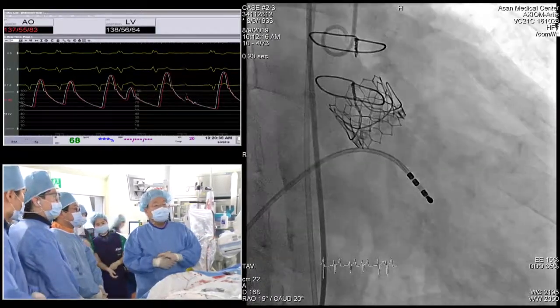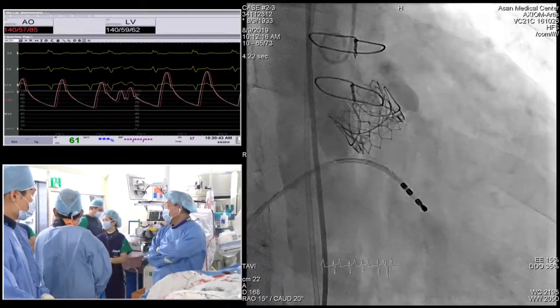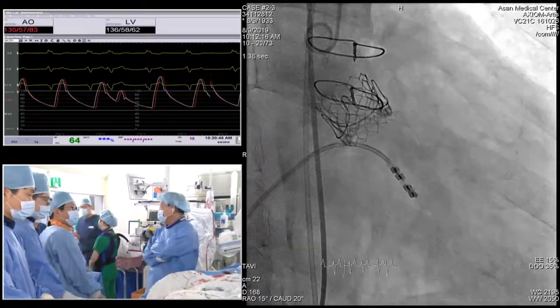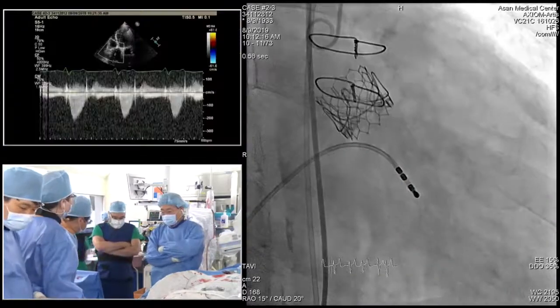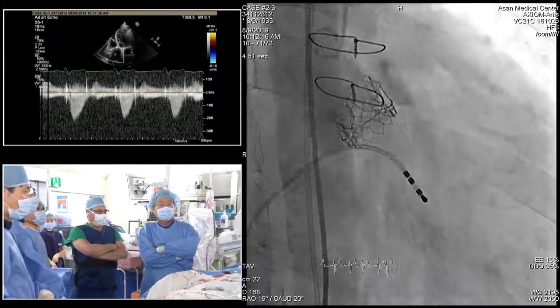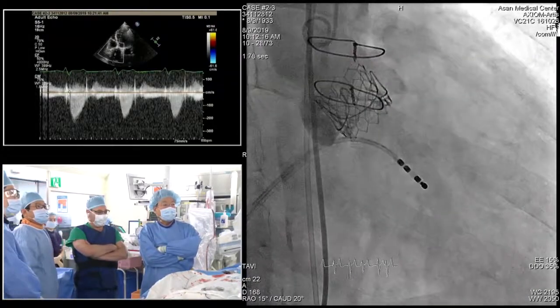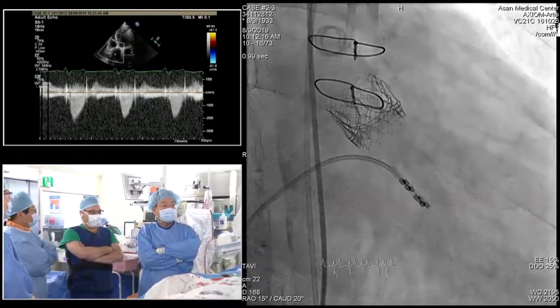Any discussion point? Do you want to talk a little bit? I can now talk about Eberhard's question about the deciding. I think the point you were talking about before we started was a good one, and it really is one of the advantages of doing the valve fracture last: you get to decide if you actually need to, and that's the way we've always practiced.